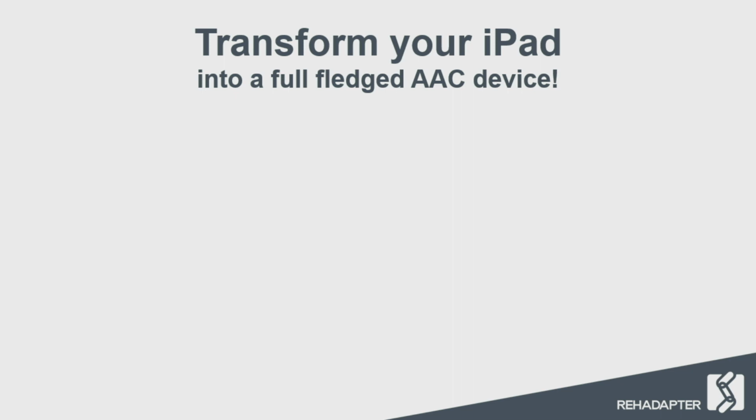But from now on, I would like to show you a solution how to transform your iPad into a full-featured and complete AAC device. How is it possible? What are your expectations about a protective case like the Rehadapter? I think all of you will agree. The typical AAC device features are that it always needs to be some sort of a protective case that prevents it from damages.